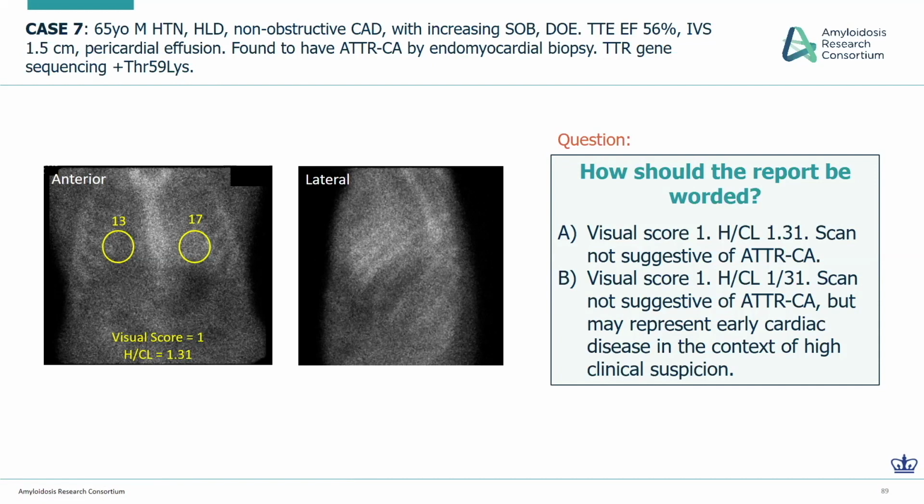Yep. And we present these latter two cases not to confuse people, but to warn you that, again, no test is perfect, particularly in these somewhat unusual mutations we've observed that scintigraphy and its yield is not ideal. Having said all that, for the vast majority of folks that you'll encounter clinically with transthyretin amyloid in the United States, that is wild-type disease, followed by those who carry the Val122Ile mutation or the Appalachian mutation, so-called Thr60Ala. Scintigraphy is a fantastic test when coupled with monoclonal proteins and has a high specificity.